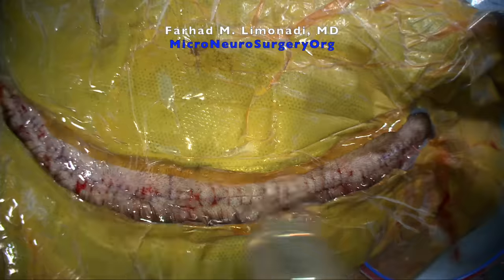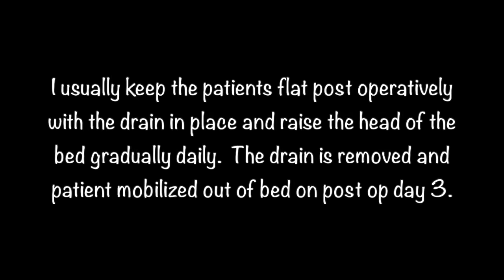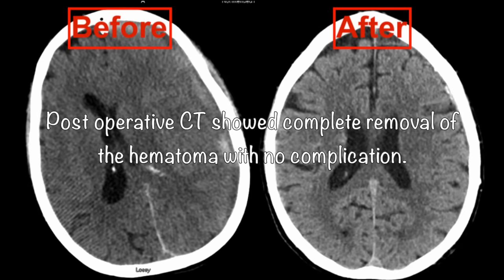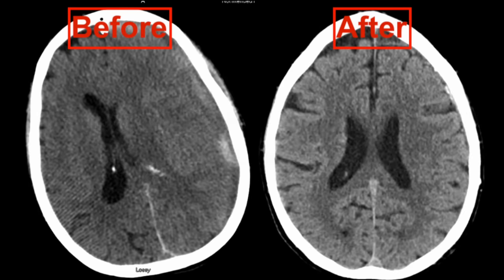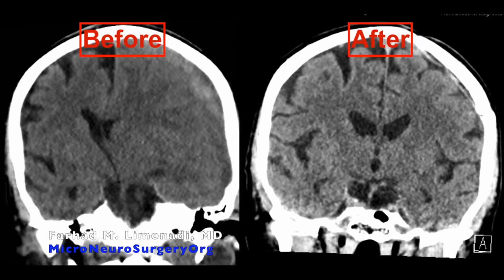I usually keep the patient flat postoperatively with the drain in place and raise the head of the bed gradually daily. The drain is removed and patient mobilized out of bed on post-op day 3. Postoperative CT scan showed complete removal of the hematoma with no complication. Most importantly, she returned to completely normal function and was discharged home.